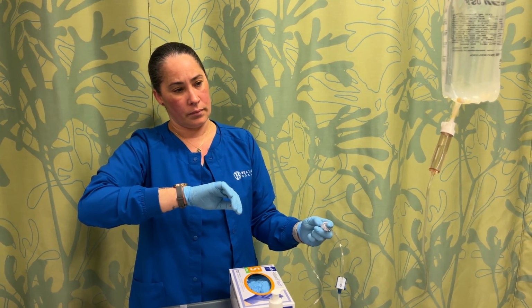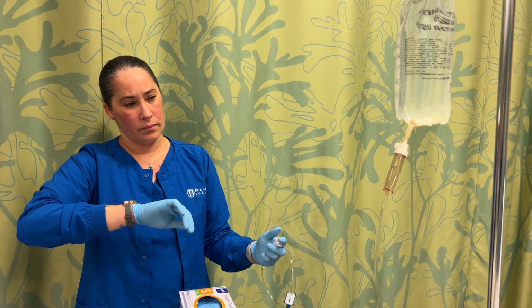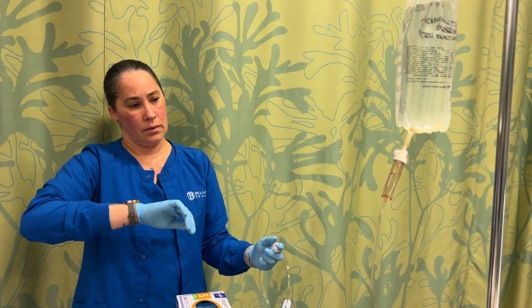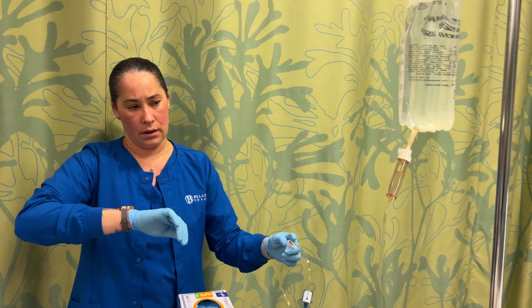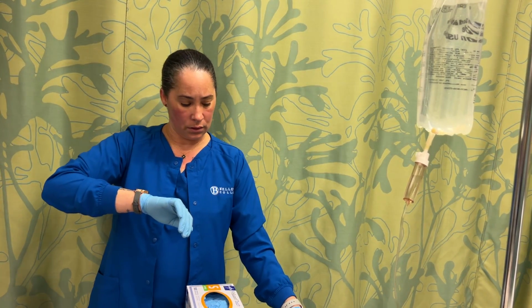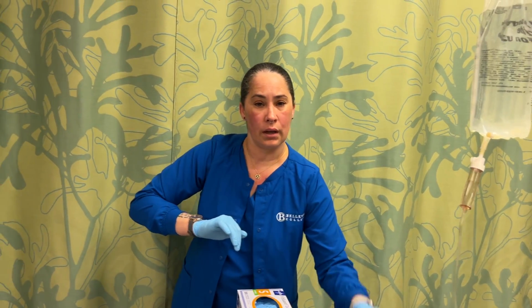We also assessed for allergies to begin with. So we did. Okay, great. Gloves on. All right, perfect. So that is our rate for the IV fluids. So that looks good, everything's good to go.